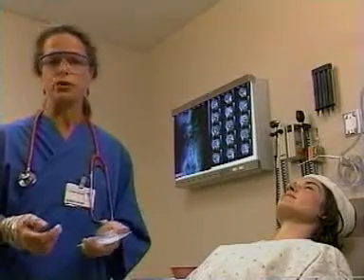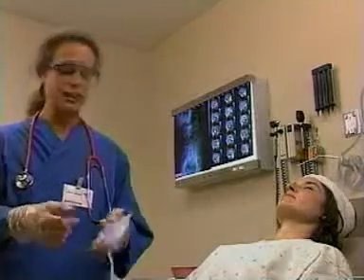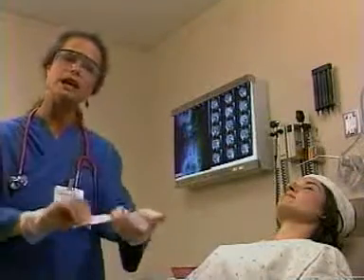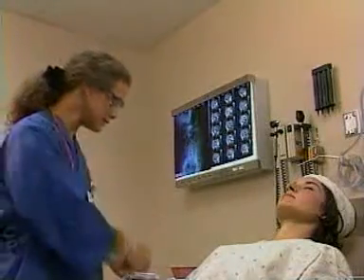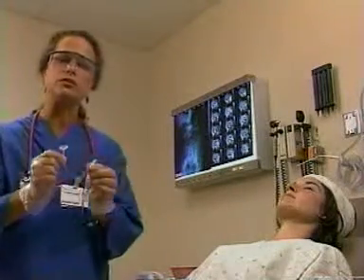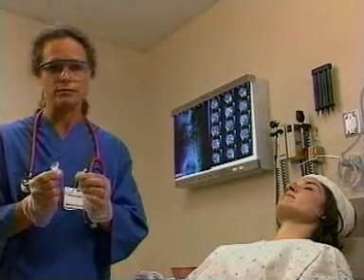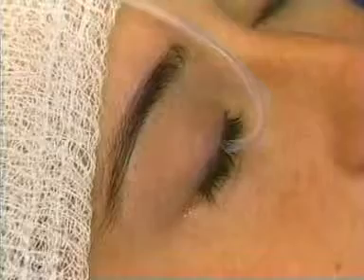Application is easy. First, if one is available, apply a topical ocular anesthetic. Then peel open the sterile packaging, and with the Morgan lens delivery set, attach an IV bag to begin a minimal flow. You can also attach a syringe for a smaller, more controlled application. Have the patient look down and insert the lens under the upper lid. Then have the patient look up, retract the lower lid, and drop the lens in place.